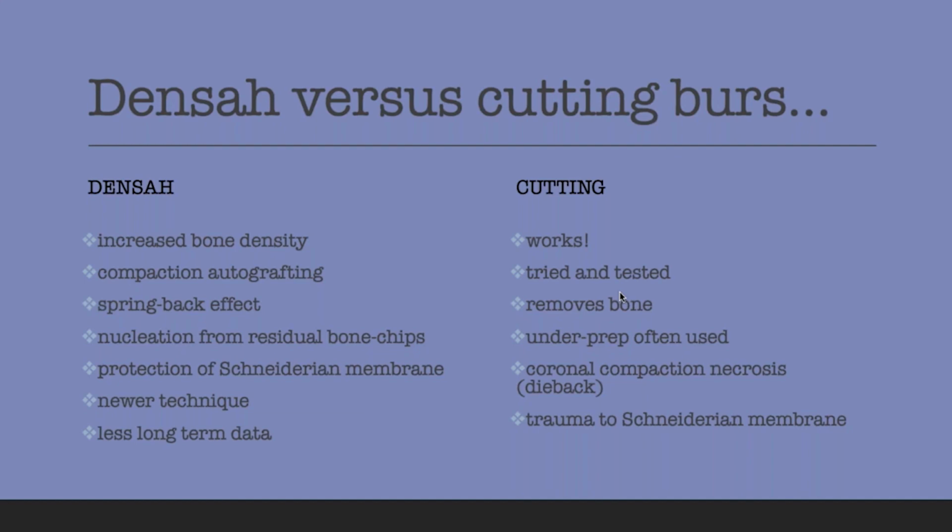You're also in a difficult position with regard to, well, what do you do with that? Studies tend to suggest that small traumatic lacerations to the membrane heal very quickly. However, you've got to use your judgment, your skill level, your experience to make those calls. But trauma's likely. I think particularly when you're using Lindemann drills, lance drills, sharp drills, trying to perforate or penetrate that cortical plate beneath the sinus, it's very easy to make a little error and just actually damage the sinus membrane.